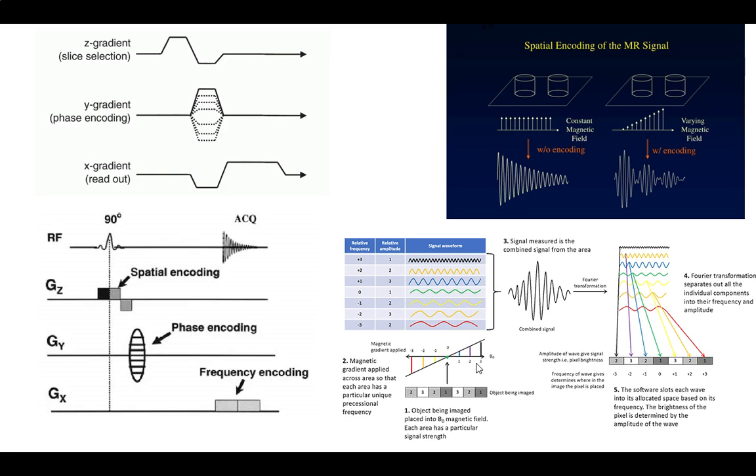Because you're trying to set how fast it's going to dephase. That's your phase shift. And different heights front to back are going to be dephasing at different speeds. That's going to set when you read it. And then I set my frequency encoding, my X direction, right at the time I'm reading that FID pulse, because that's what's going to tweak the difference. They're all going to be reading out right to left. This field will just slightly adjust them. So the ones on the right are at one frequency, left at a slightly different frequency. So a good FFT will resolve them.